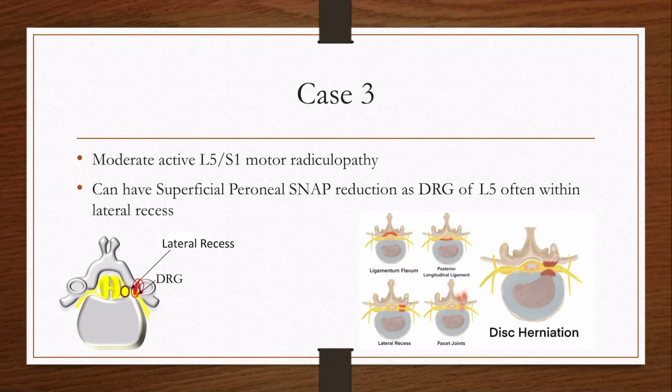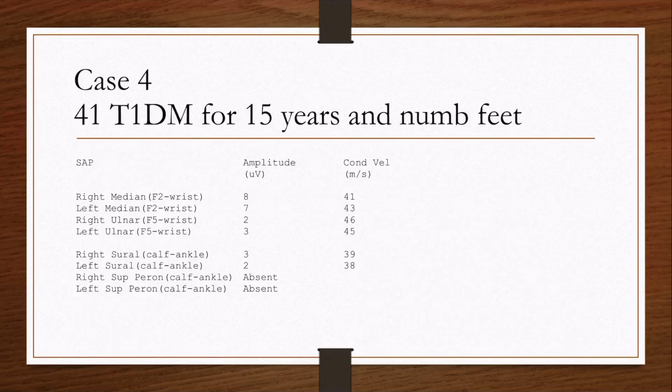So that's just something to be aware of, to look out for. It's something that we commonly see. It's rare that we see it completely obliterated. Usually there will be a little bit of something left, but it's just something to bear in mind. That's the caveat for the localization differentiation between pre and post ganglionic processes using the sensory action potentials.